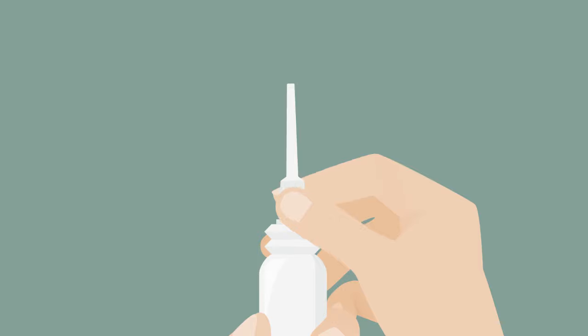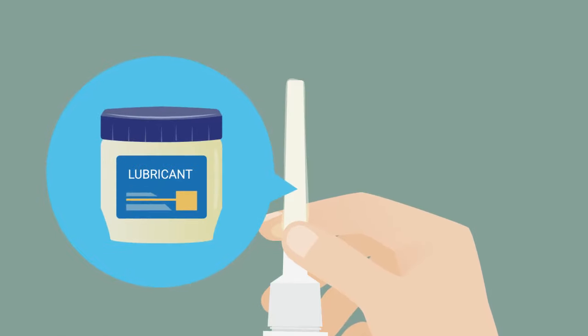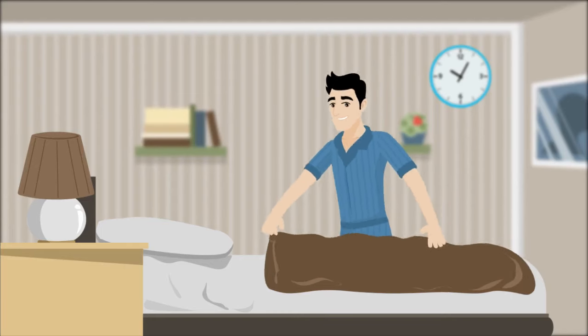Remove the cap and tighten the nozzle firmly onto the bottle. If you wish, you can apply a lubricant to the nozzle to ease insertion. Place a towel on your bed.